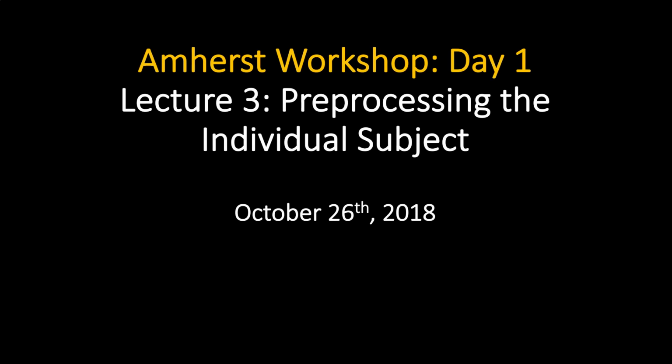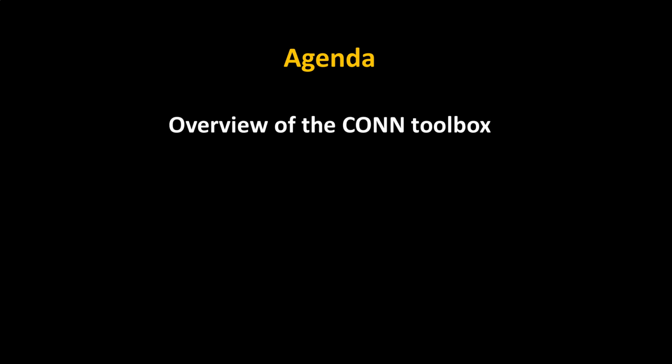Previously, I talked about the differences and the similarities in pre-processing task data and resting state data. So if you already have a handle on processing task-based data, a lot of this may be review to you, but I still want to cover it, give you a sense of what is going on at each of the different steps. And moving into this afternoon, we're going to overview the CONN toolbox.